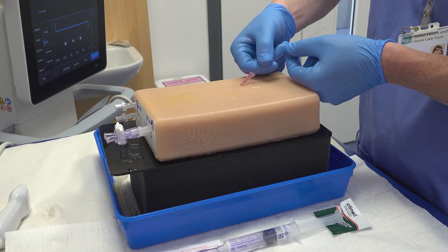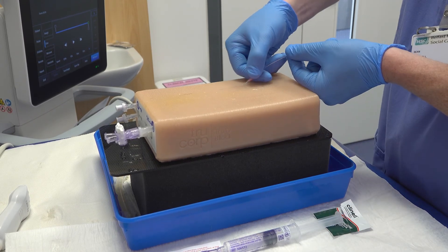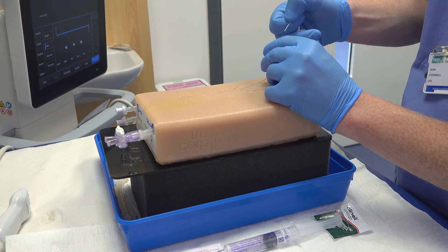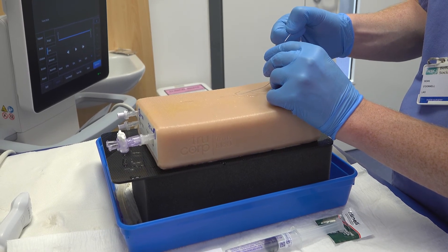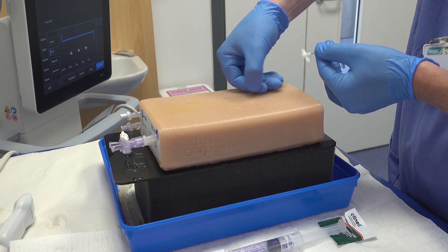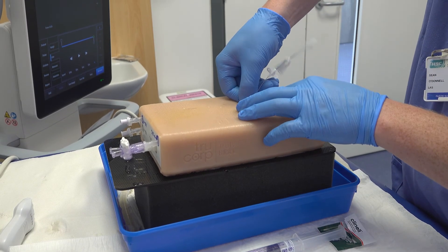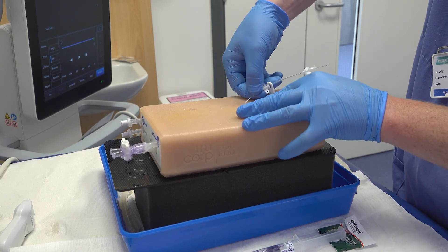I place the guide wire that came with the kit into the cannula. Once I feel this moving freely up the blood vessel I can remove the cannula. I then place the midline onto the end of the guide wire and slide this up towards the skin. I ensure the guide wire is sticking out of the end of the line so it won't get lost into the vessel. I place some tension on the skin to help pass the line through the fascia into the vessel.